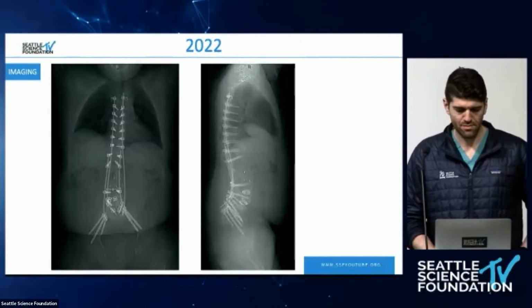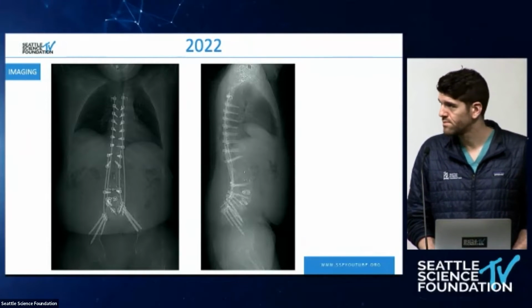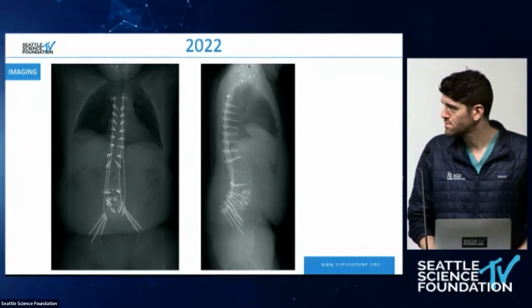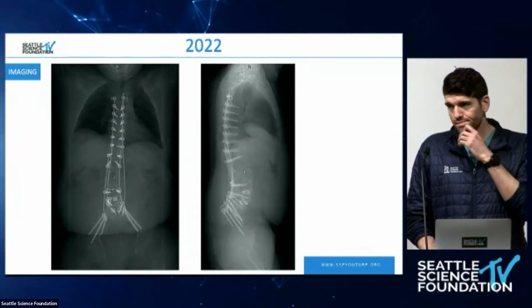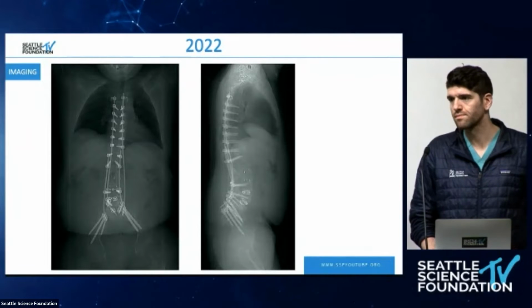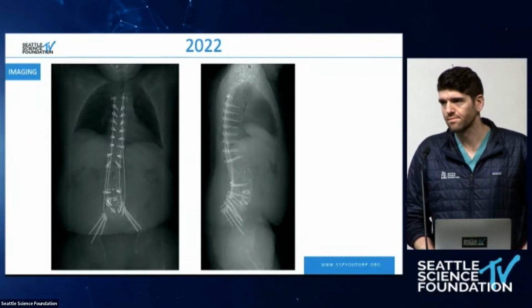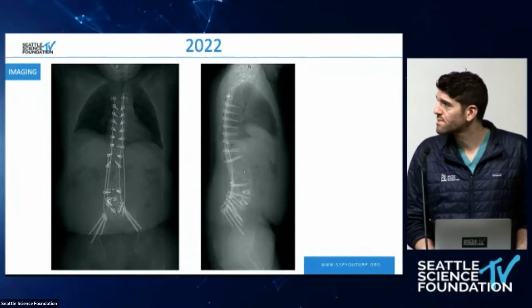Dr. Sardar, I don't know if you can see the scout there, but it looks like he fused. I just saw him in clinic. It looks like he's fused at L5-S1, but I'm not sure it's totally healed at L4-5. The Charcot area looks like it's healed, but he's wheelchair bound, and the pelvis and lumbosacral junction in these longer constructs can be really difficult to get to heal.